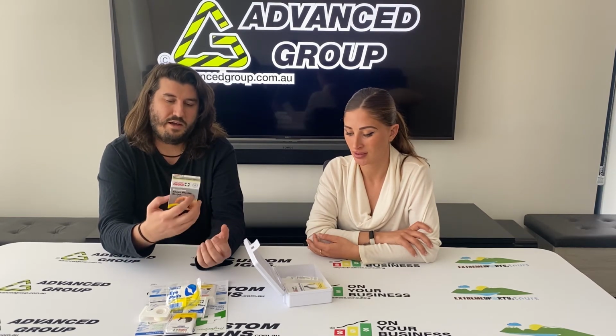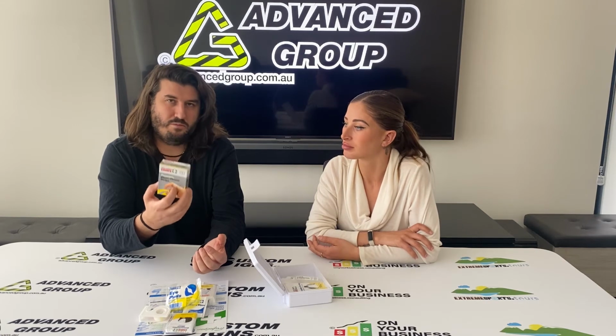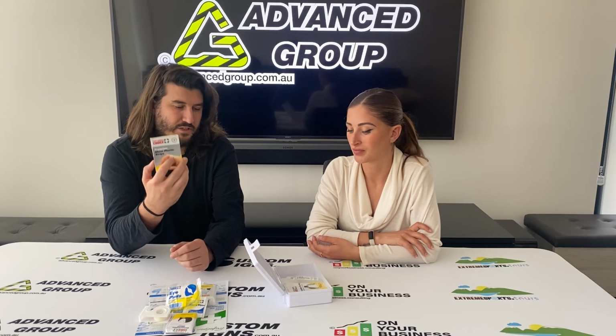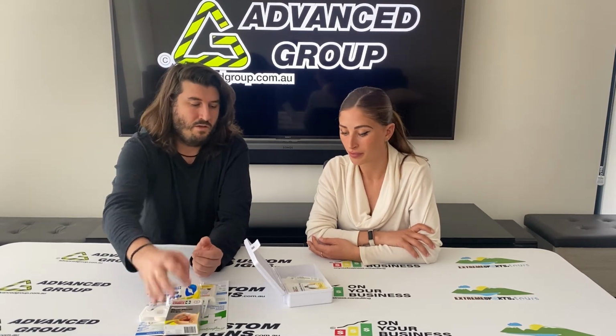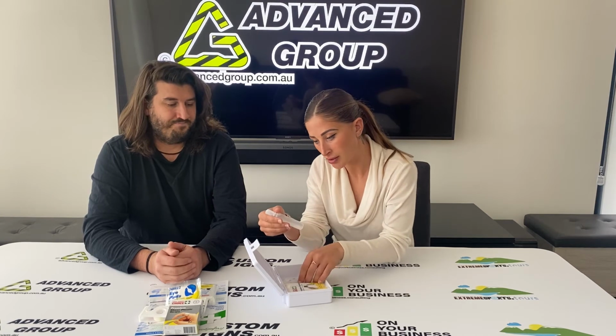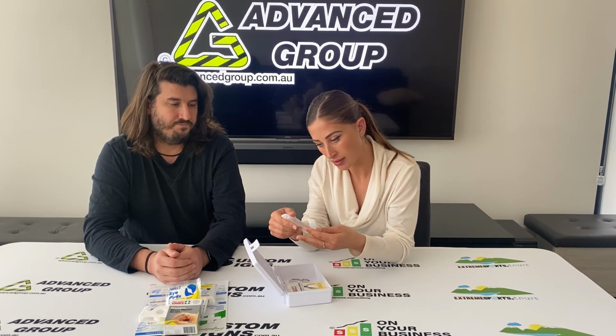That's a 50-pack. You'll probably find that most first aid kits will get a lot of Band-Aids pilfered out of them more than anything else in the kit, which is pretty easy to replace if you are making sure that you audit your kit semi-regularly, just to replace the Band-Aids if this box gets taken out, or if some of them get taken out of the box. This is probably one of the most used things in a first aid kit.